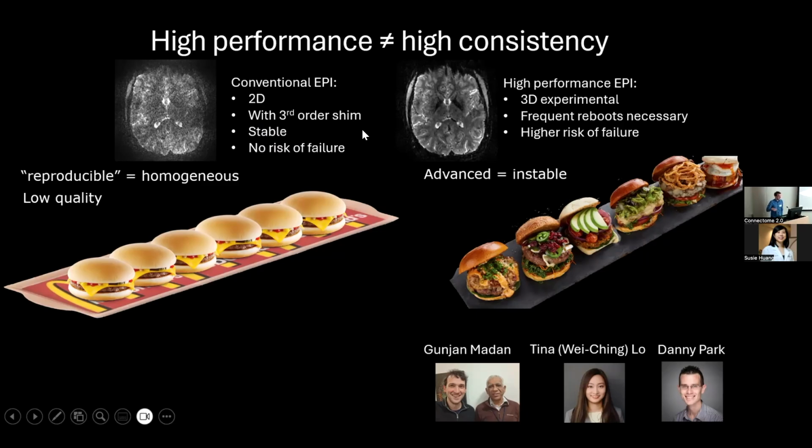So I think in the next few years, we need to have a kind of trust building campaign to make these ultra high performance scanners interesting for fMRI folks and show that they can be stable if we do it right.